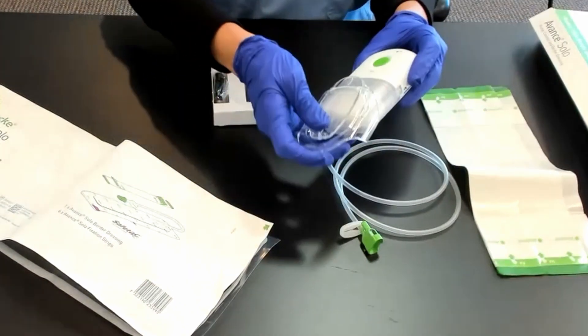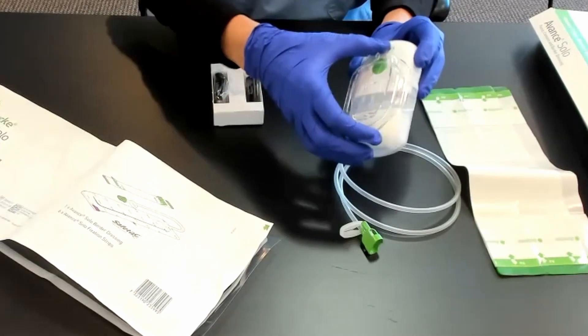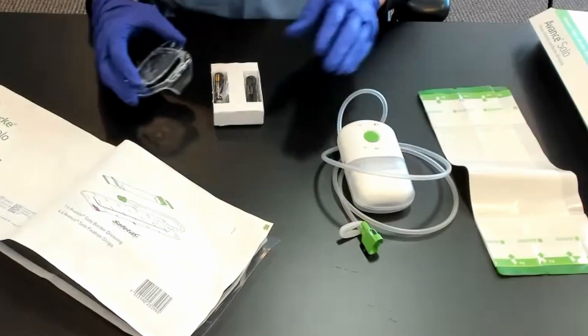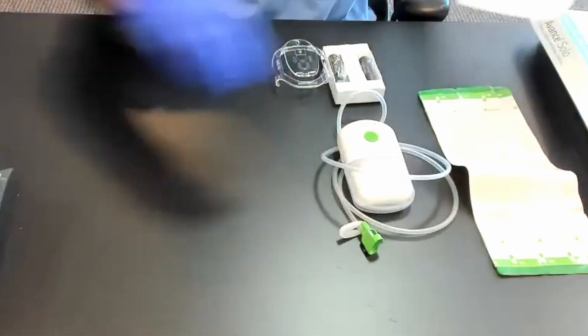There is a clip that goes on the pump, and then it can clip to the patient's belt so that when they're walking around they don't have to hold onto it — which is nice. There are also spare batteries included.